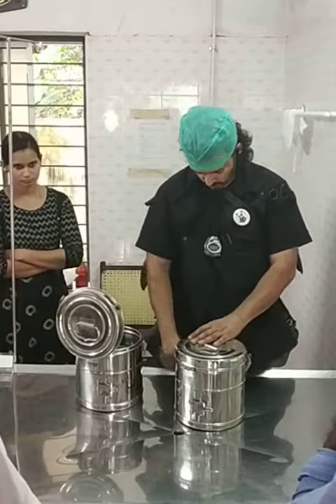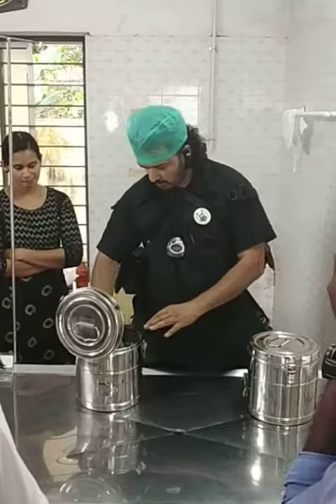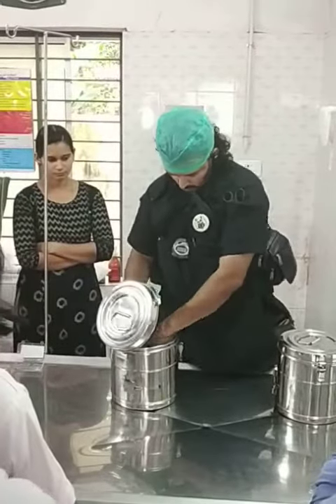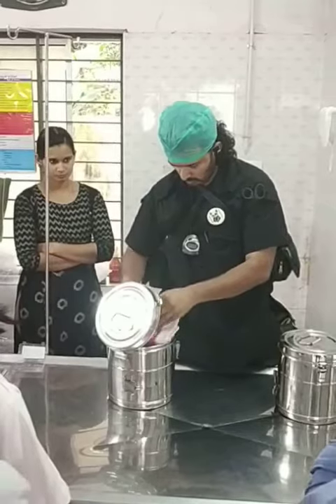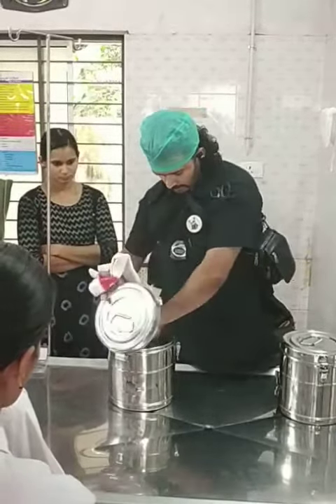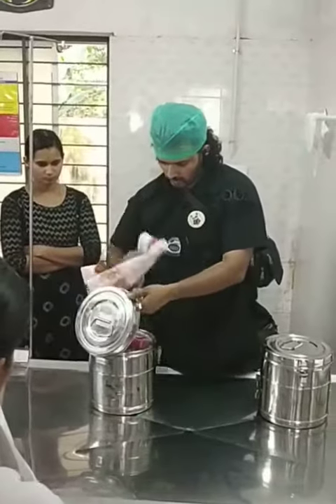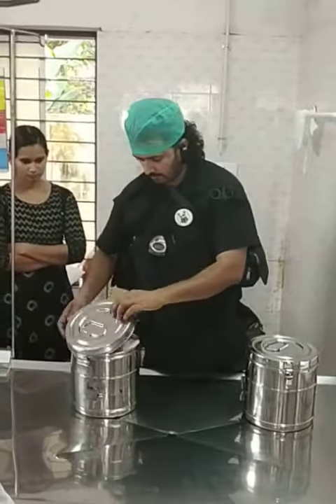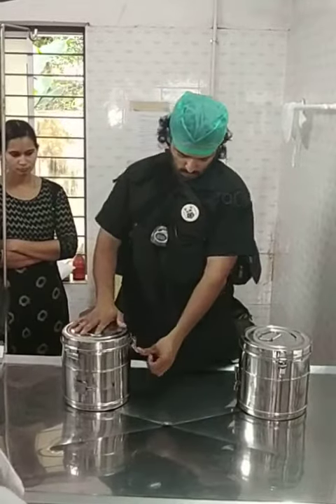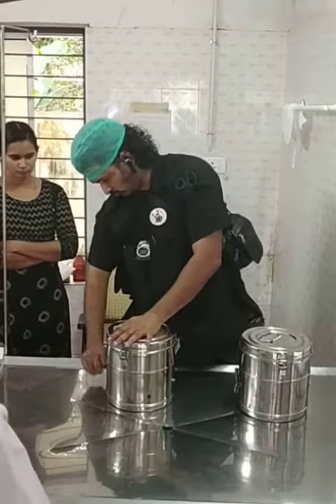I can use these. The first step is to get the size of the bag, so I can use these for the first step. You can use these for the second step.